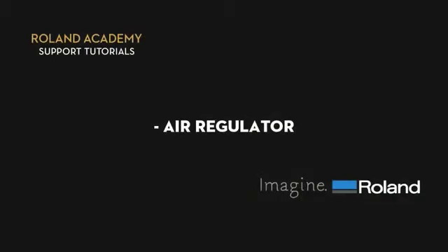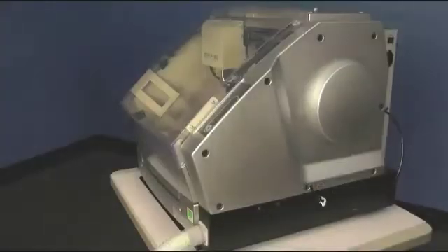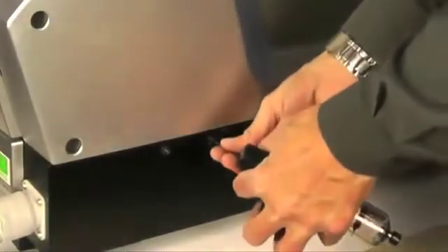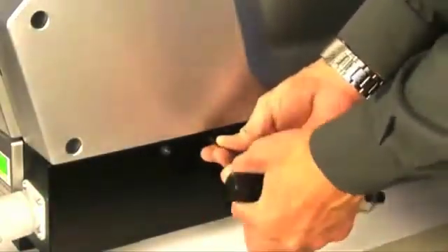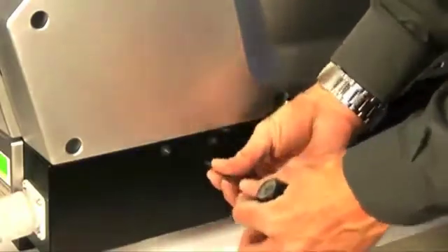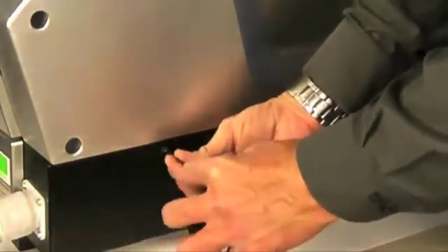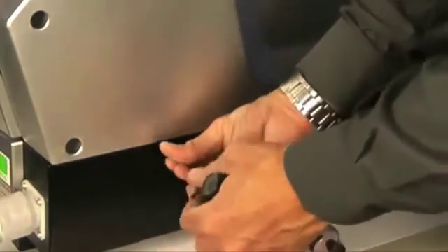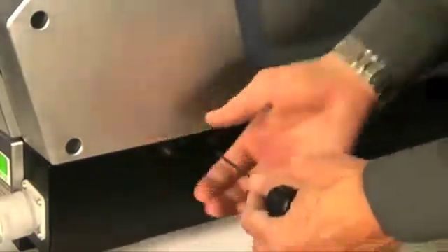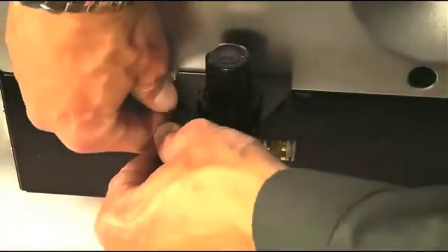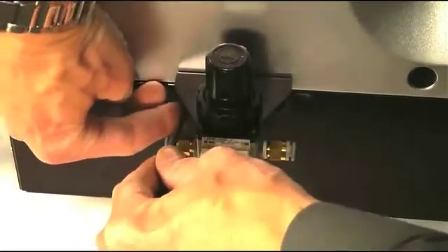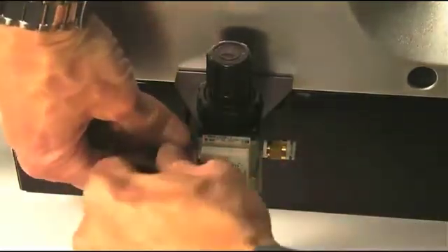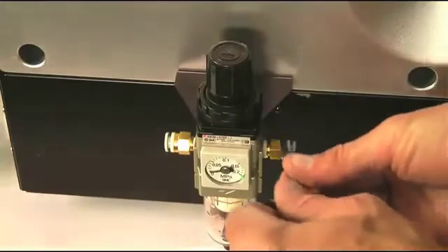You are now ready to attach the air regulator to the machine. To do this, first locate and loosen the securing screws on the right side of the machine that allows the recess on the rear of the regulator to fit over the screws. Once the retaining screws have been loosened up enough to fit the recessed portion of the regulator over them, slide it into place and then retighten the securing screws to be sure that the regulator is securely fastened to the machine.